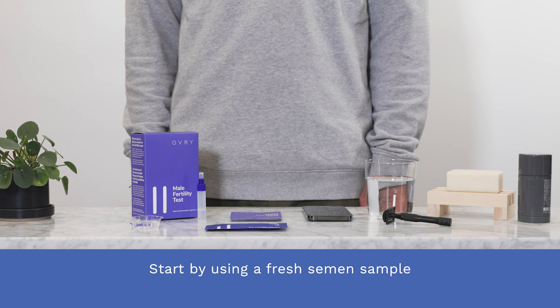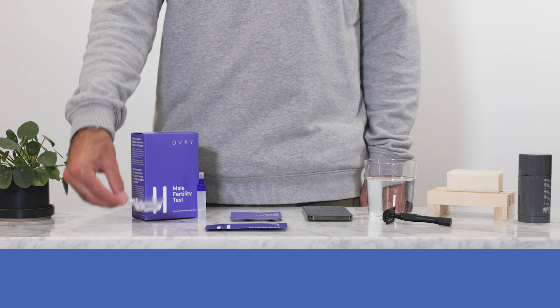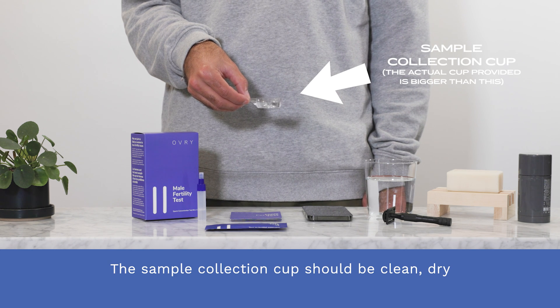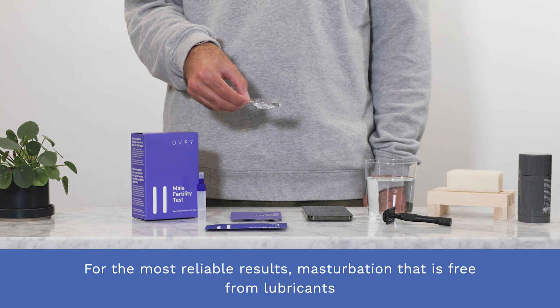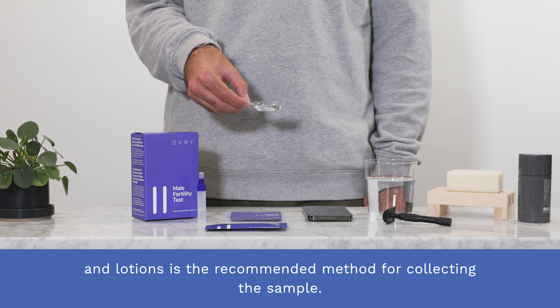Start by using a fresh semen sample collected two to seven days after your last ejaculation. Collect the semen using the sample collection cup. The sample collection cup should be clean, dry, and free from any contaminants and detergents. For the most reliable results, masturbation that is free from lubricants and lotions is the recommended method for collecting the sample.